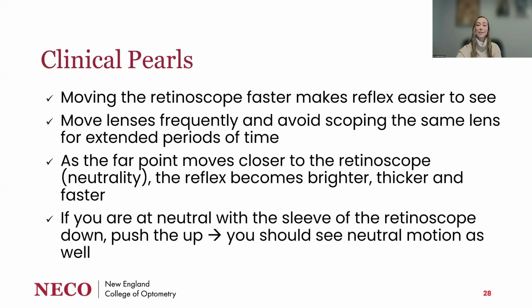Make sure that we're moving the lenses frequently and avoid scoping that same lens for extended periods of time. Accommodation can actually induce against motion, so we don't want to keep scoping the same lens in front of the eye for too long for fear that the patient might accommodate through it and give us false results.